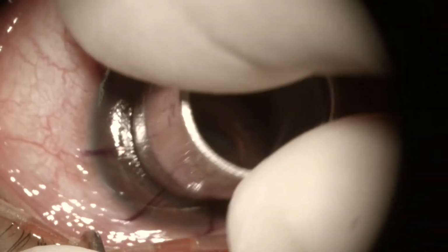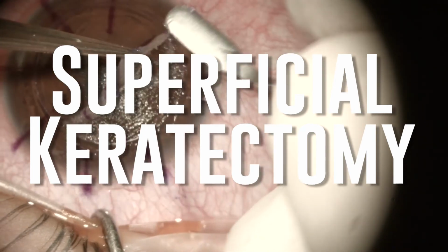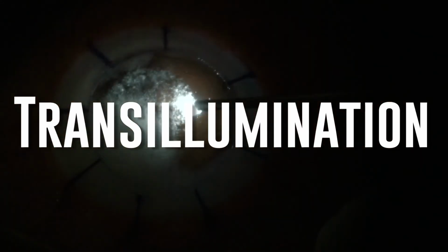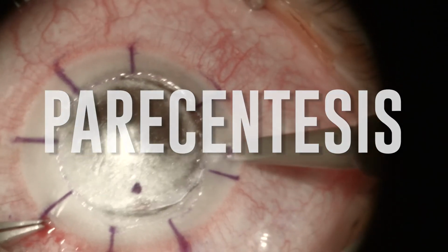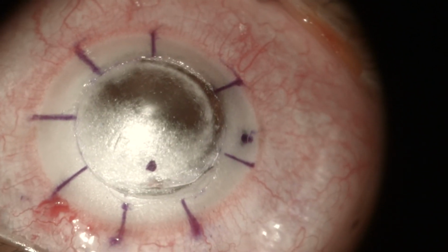So in conclusion, here are some tips. Partial trephination, superficial keratectomy, inject air in the thicker area, use corneal transillumination in every step, paracentesis and decompression after big bubble or working on the deepest layer in manual DALK.